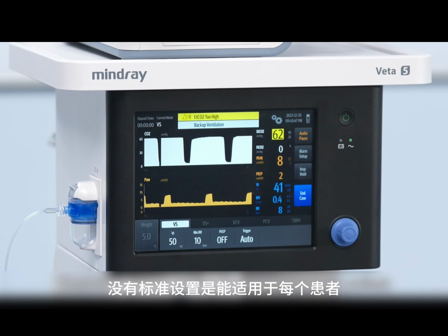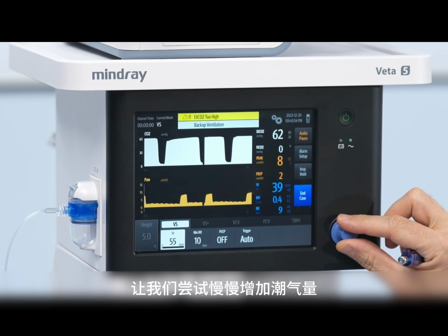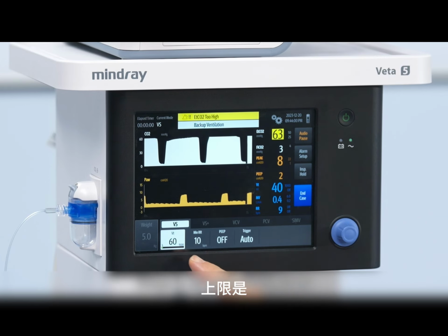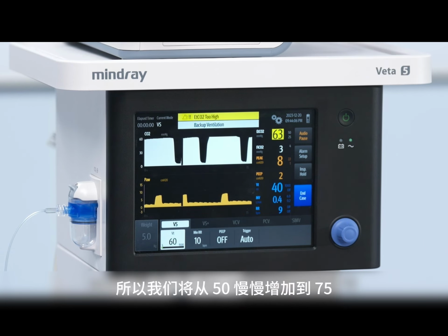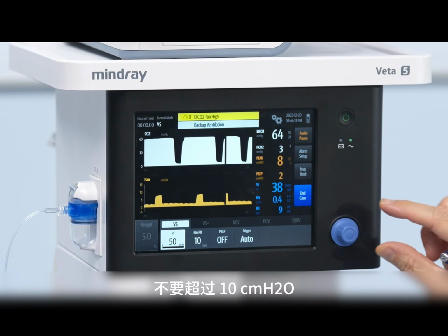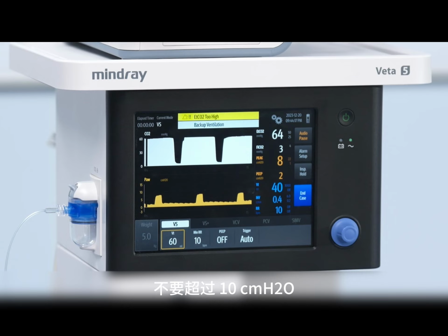There is no golden setting that works for every patient. So let's try to slowly increase the tidal volume. We started from 10 milliliter per kilogram, which is 50, and the upper range is 15 milliliter per kilogram, which is 75. So we will slowly step up from 50 towards 75 and watch out for the peak inspiratory pressure not to exceed 10 centimeter of water.